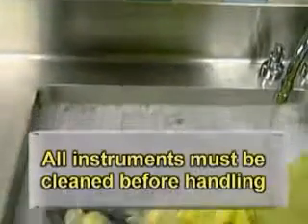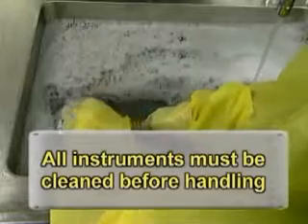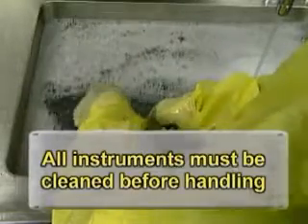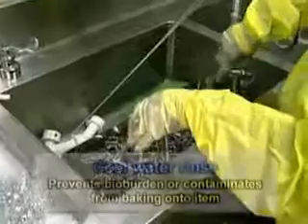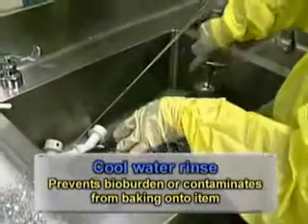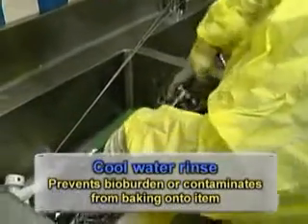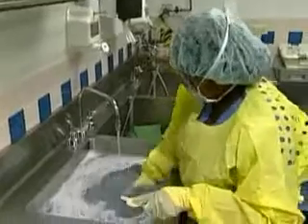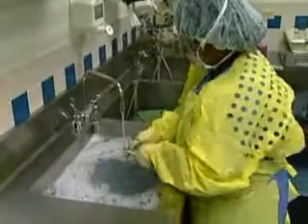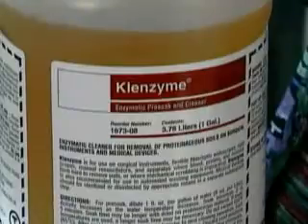Cleaning can be accomplished either by hand or mechanical methods. Regardless of the method, some basic principles hold true. The first step should be a cool water rinse to get rid of gross debris. Cool water will prevent the possibility of bioburden and/or contaminants from baking onto the item. If the device is heavily soiled with protein or fat, or if the soil has dried on, an enzyme detergent might be helpful as the step after the cool water rinse.